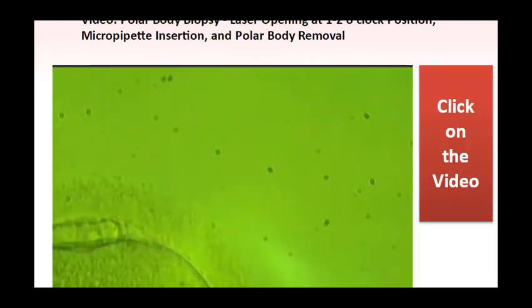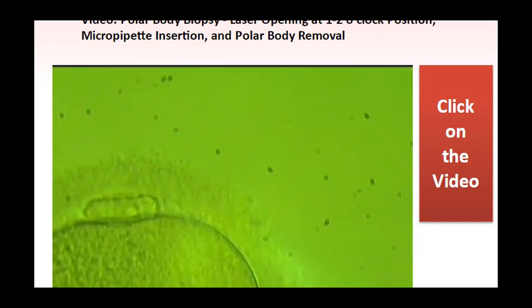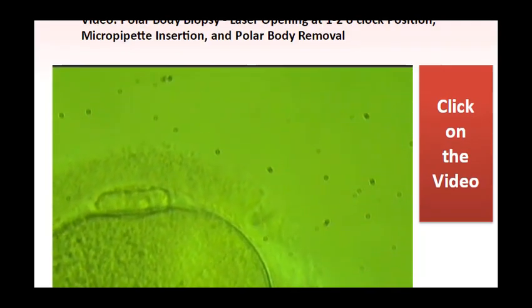This video shows a polar body biopsy. The micropipette is inserted through the laser-created opening at the 1 to 2 o'clock position, and the polar body is removed.